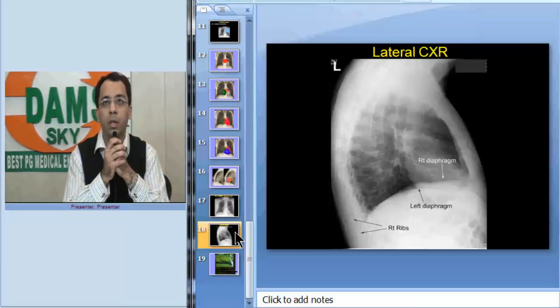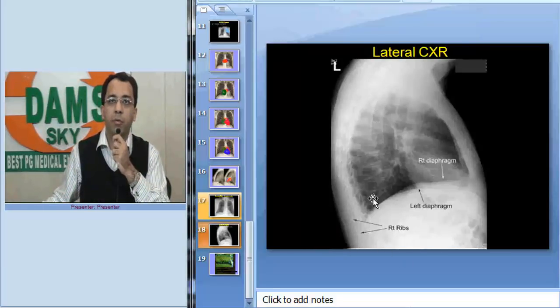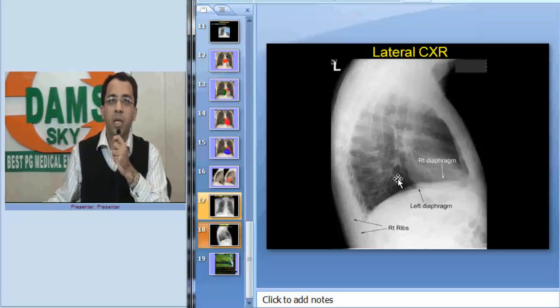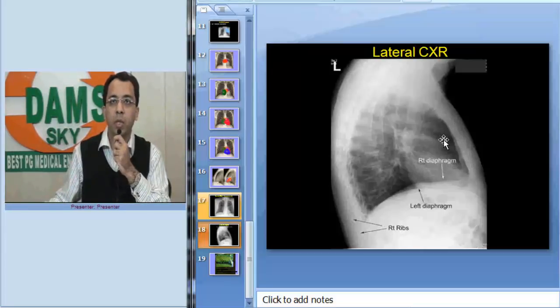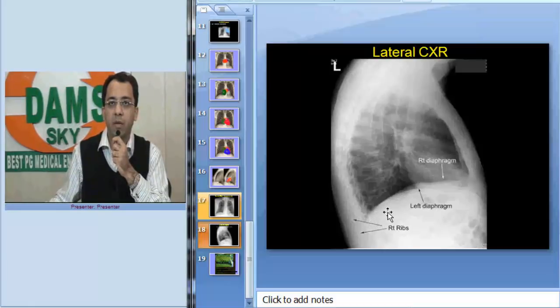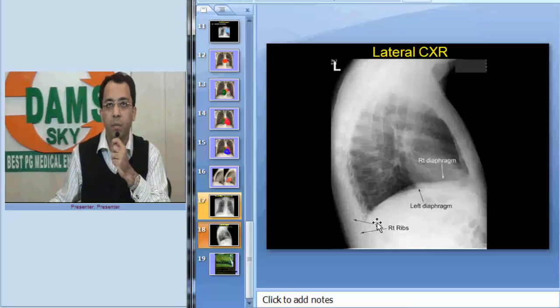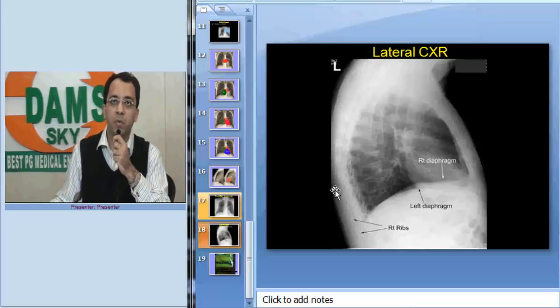Now let us look at the lateral film. When I look at the lateral film, I look at the vertebra and sternum. Notice that the density of air becomes more lucent toward the base — if someone has a lower lobe pneumonia, this area would look denser. I look at the retrosternal space and retrocardiac space — right ventricular hypertrophy would obliterate the retrosternal space. I look at the diaphragmatic contour: the right diaphragm is complete on a lateral film, while the left diaphragm is incomplete because the heart sits on its anterior part.